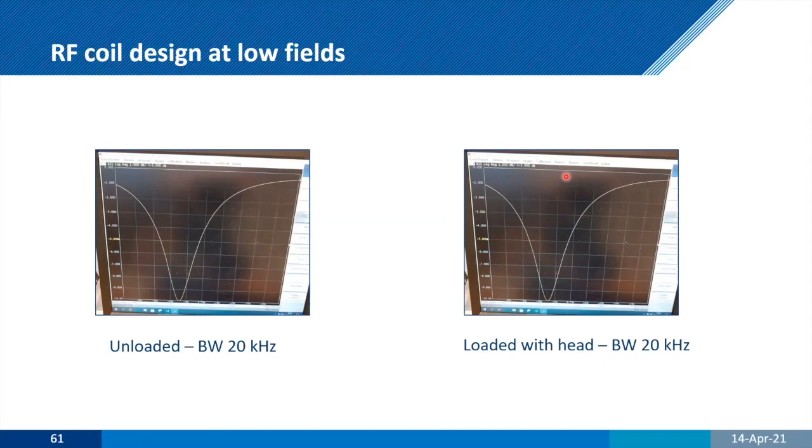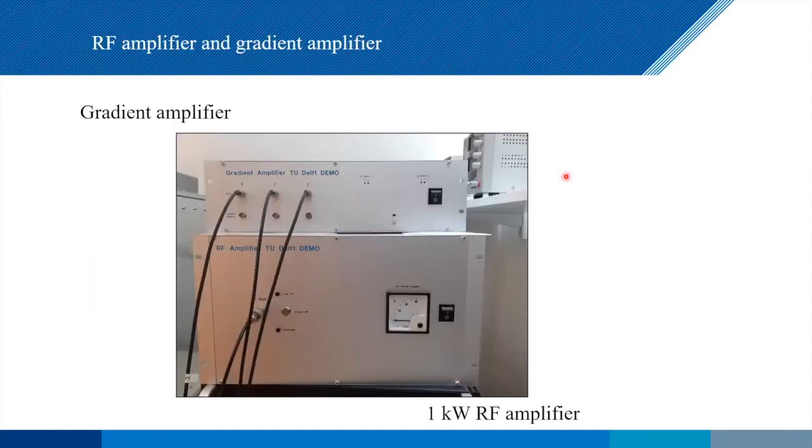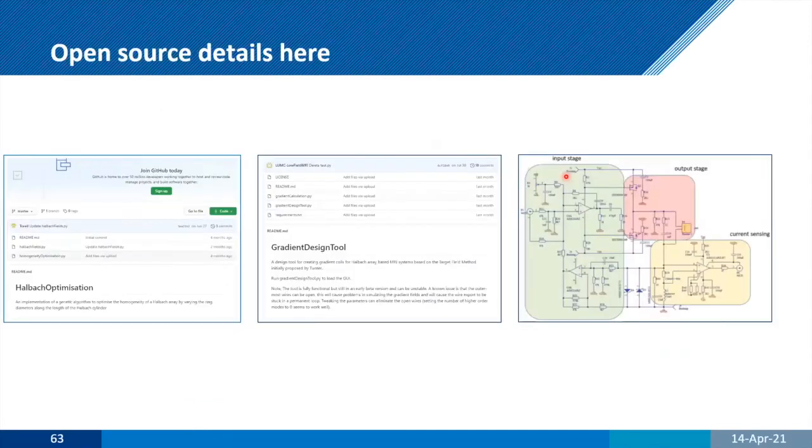Others, of course, have considered this. Greg Scott has a large thesis on this. But it was just one of those things that coming into this, we hadn't really thought about too much. And so for the rest of the plate, then we have the gradient amplifier and RF amplifier. Again, these were designed to be easily repairable, to be modular. And these are costing roughly $1,000 each. And everything here is open source.